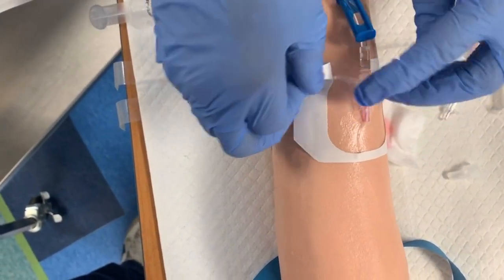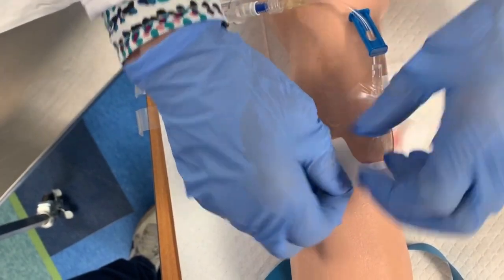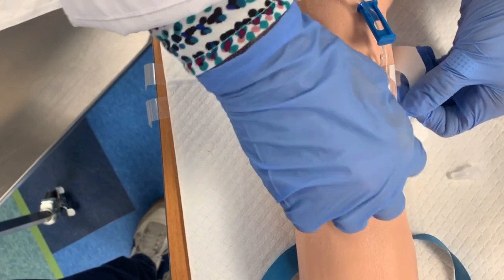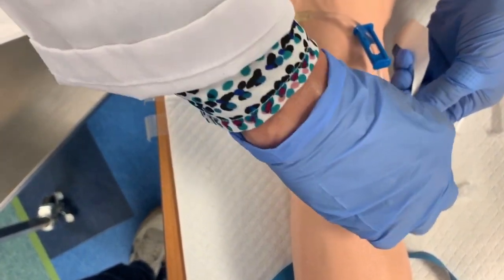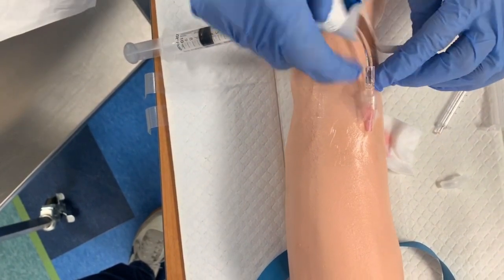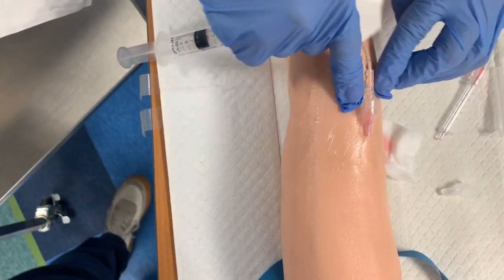And why do you think that's important? Well, we don't want any bugs or bacteria or dirt getting into here, so we want to keep this IV nice and sterile. Peel this off really carefully so it doesn't come up, and see, now we've got a nice tight seal.